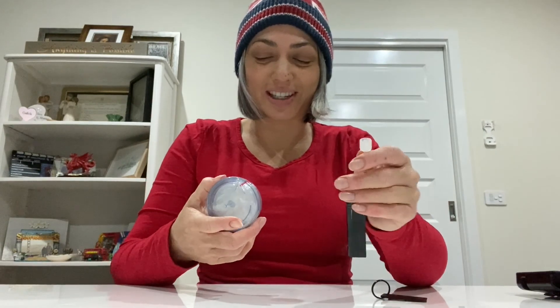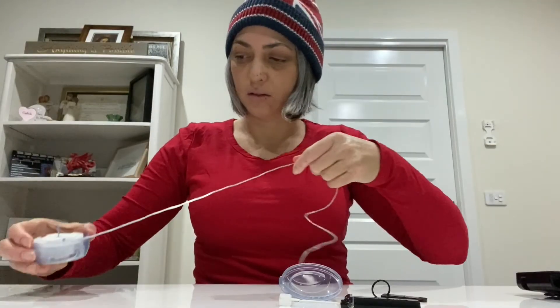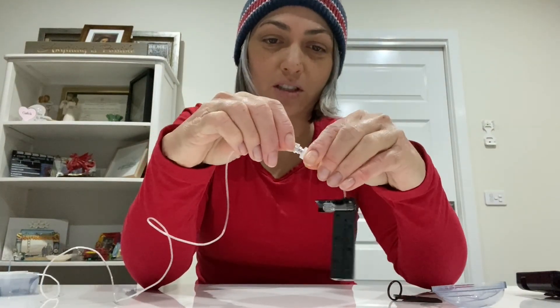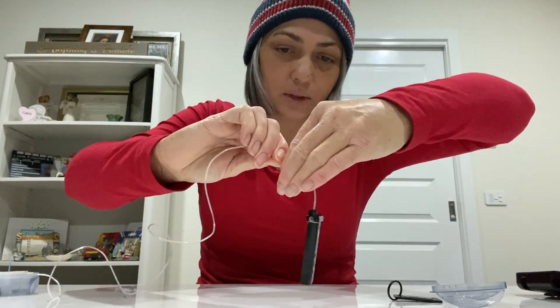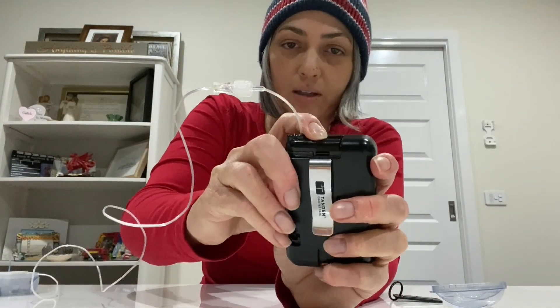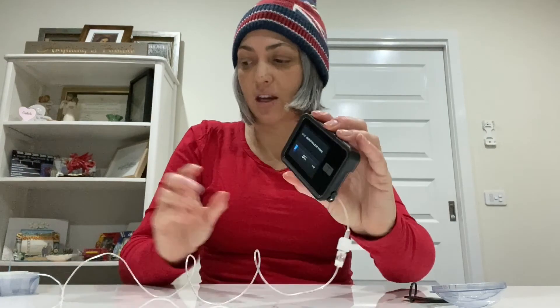Before inserting the cartridge, I'll put the line in first. This is the line that connects from the pump, and the site attaches to my body to deliver the insulin. I'm going to attach the tubing to the cartridge and tighten it — really tight, as tight as you can. Then I slide the cartridge into the T-slim until I hear a click. On the screen I go to load pump, change cartridge, confirm yes, and it detects the new cartridge installing, going to 100 percent.